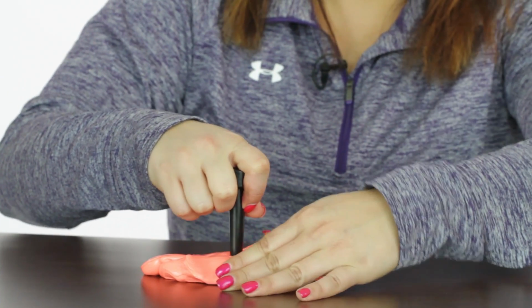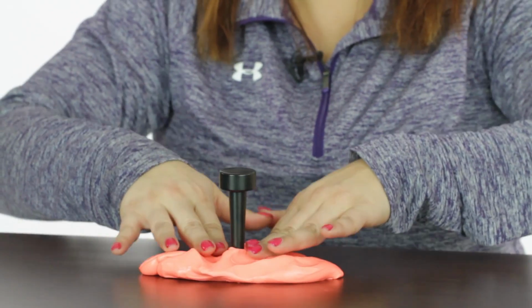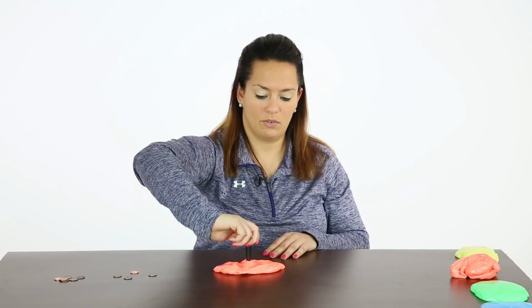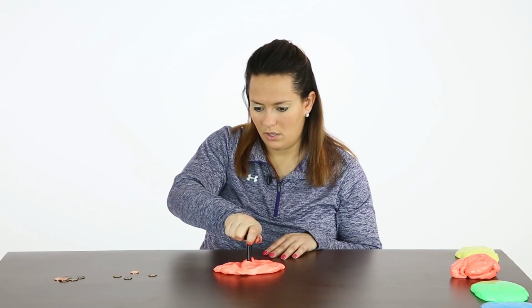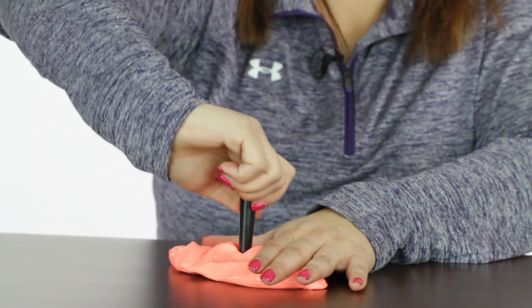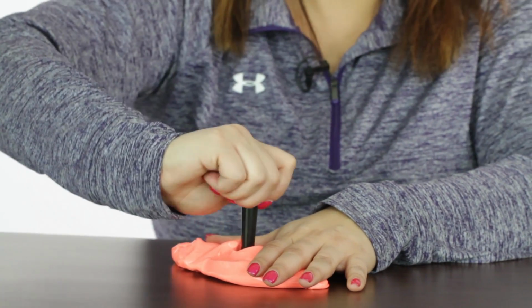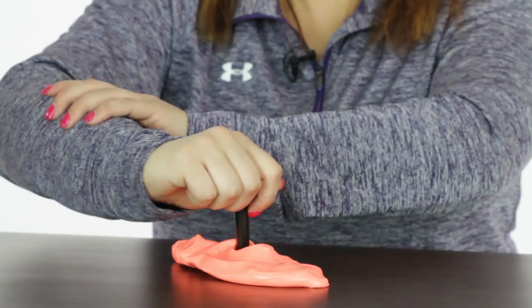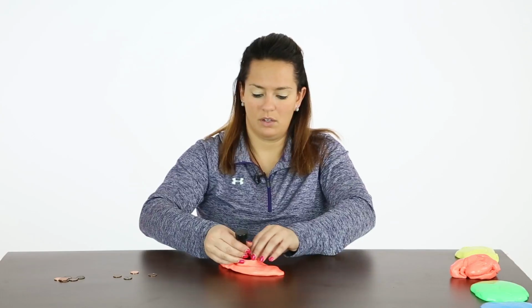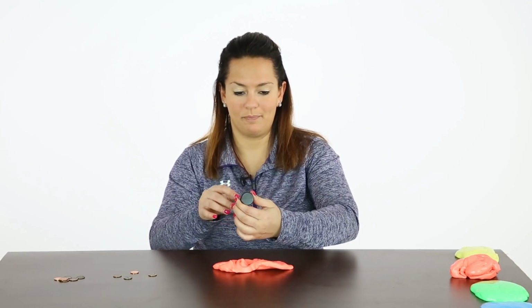So we're going to again hide the T portion of the lever. We're going to use these 3 grasp fingers that you use to turn if you're opening a soda bottle or a ketchup bottle. So really just working on that rotation of the hand and forearm to twist and turn. And that is the Putty Size Cap Turn.